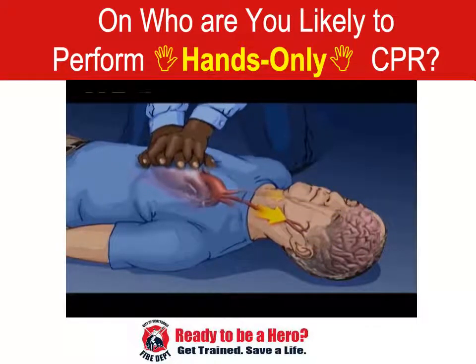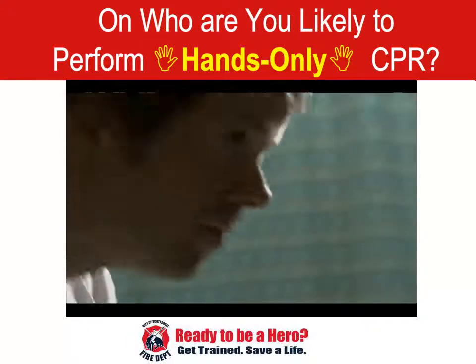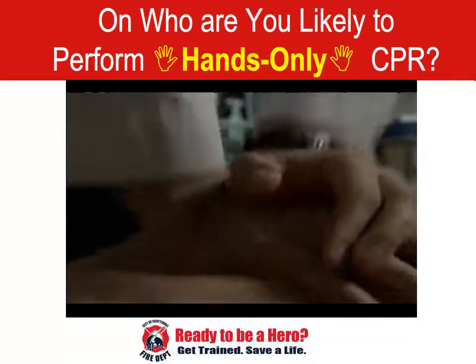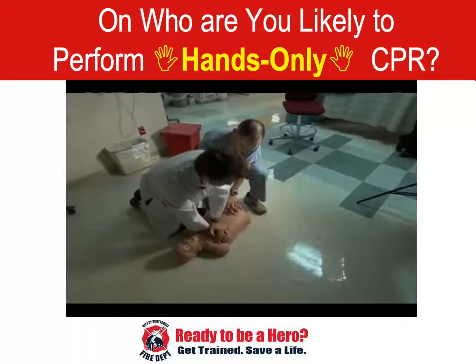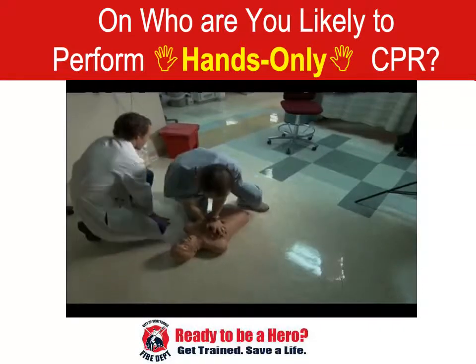Continuous chest compression CPR keeps the oxygen-rich blood flowing. The key is to circulate that oxygen. The way to do that is to continuously push hard and fast on the chest, without stopping to breathe for the patient. This makes the process easier to learn, remember, and to do. No need to count compressions or breaths, and no need for mouth-to-mouth breathing.